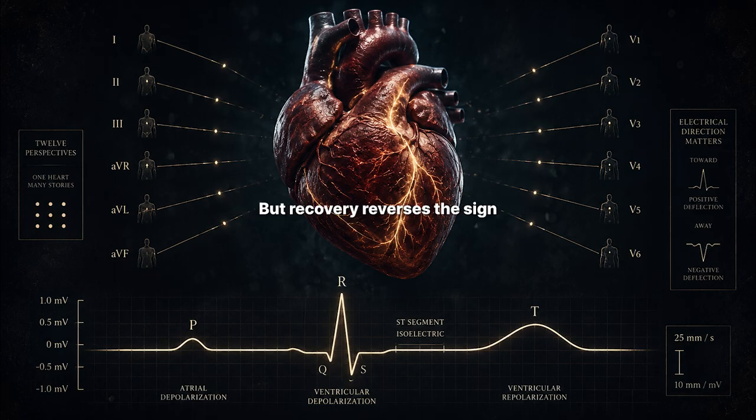But recovery reverses the sign. A repolarization wave moving toward the positive pole tends to fall. Moving away, it tends to rise. Ventricular recovery often travels opposite to ventricular activation. Opposite direction, opposite electrical sign.